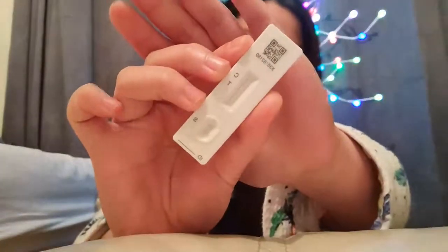Let's open the cartridge first — I've already told you it looks like a pregnancy test. As you can see, there's letter C, letter T, and letter S. S is where you put the sample — two drops. What is recommended with this one is to put it in a glass bottle so it stays upright. But for me, I'm just going to hold it, because it's easier rather than putting it in a glass. The important thing is to keep this area sterile. Now we're going to get this solution and add six drops to this one, without touching the tip.